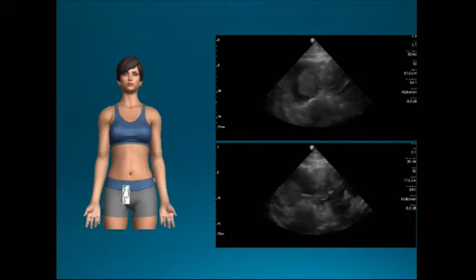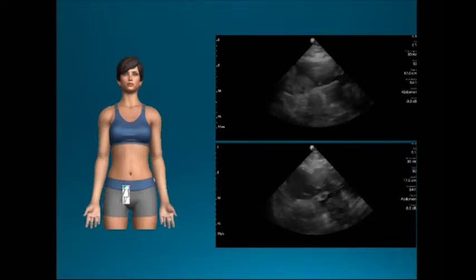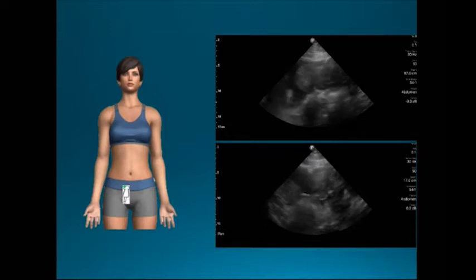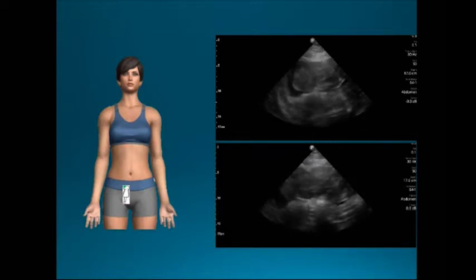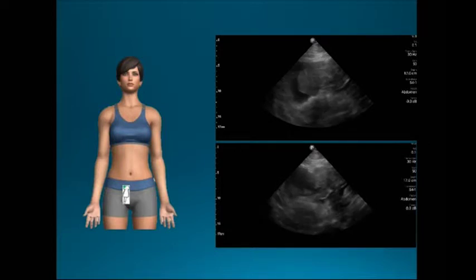So I was able to very quickly triage this person who I'm thinking, going to give some NSAIDs, counsel her about inguinal hernia, see if it gets better. If it doesn't get better, I'll send her to a surgeon and things like that. After this, I was essentially like, we got a problem. You need a CAT scan. That pre-authorization form was super easy because I was able to click, was this finding confirmed with any other ultrasound imaging? I was like, yes. Very easy to get that pre-authorization form.